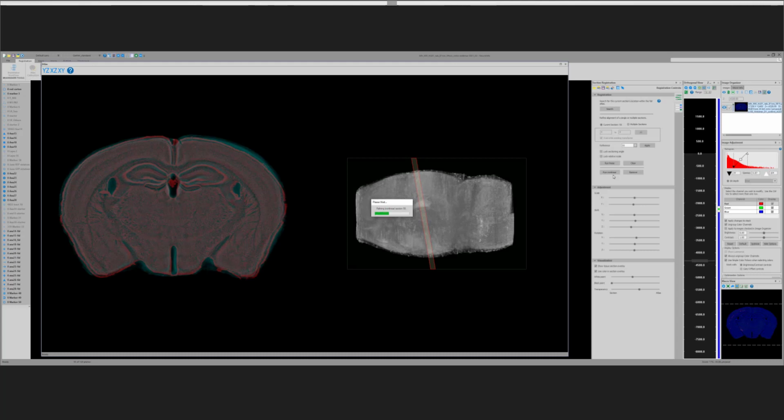That can be distortion caused by the cutting process, by the knife, or it can also be differences between animals. With linear registration, we're mapping a plane onto a plane, and straight lines stay straight. With nonlinear registration, the straight lines don't stay straight anymore, so we can have local deformations that better match the structure that we find in the brain.